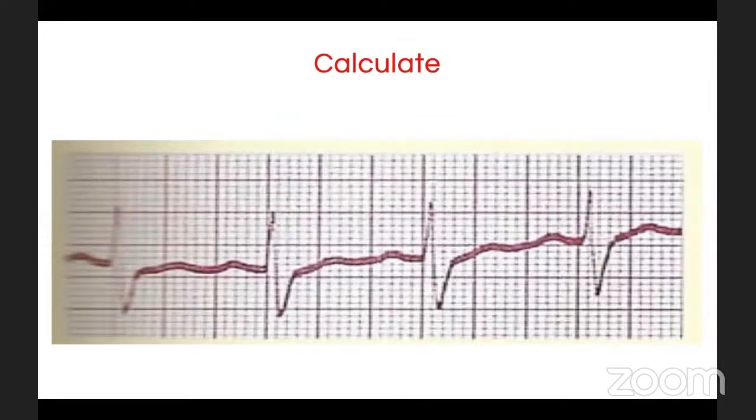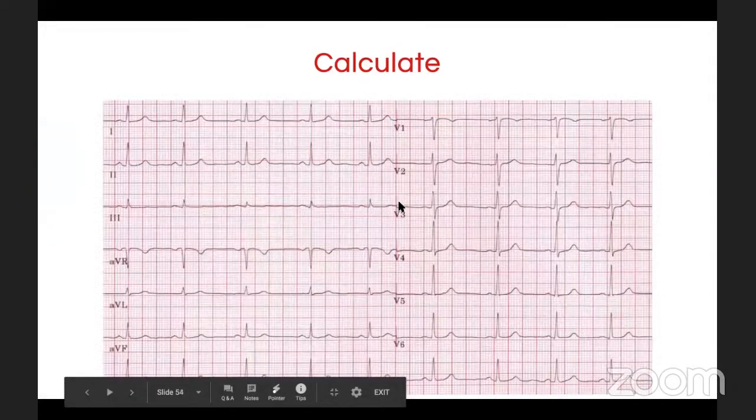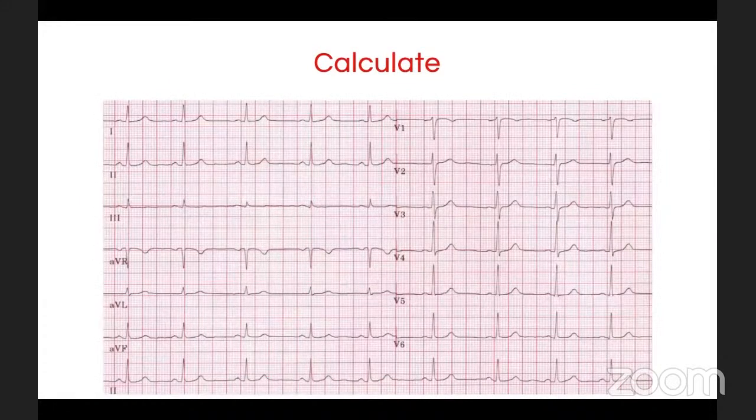مين يعرف؟ مين يقدر يحسب لي هذه؟ أوكي ممتاز، 300 150 100، ممتاز شكرا. طيب اللي بعدها، ممتاز كلكم 100. طيب الحين نحسب هذه. نشوف الآر الأولى والآر الثانية. يلا مين يحسبها؟ أوكي صح، 4 boxes 75. ممتاز. يعطيكم العافية. next، ممتاز 75 4 boxes.